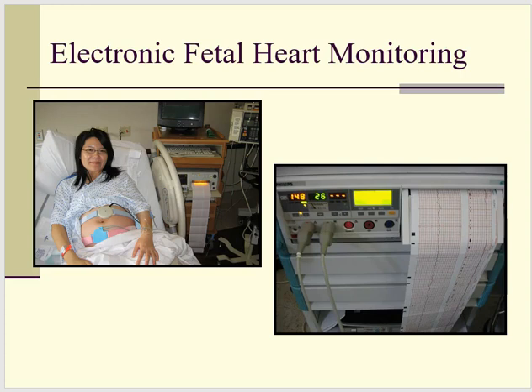Electronic fetal heart rate monitoring is a system that involves usually this little machine over here. You can see you can have the information printed out on a long strip of paper. There is also a computer up here. Most often in clinical, you're going to see nurses using the computer here and not printing out paper.